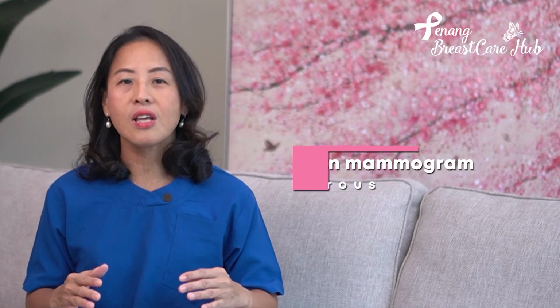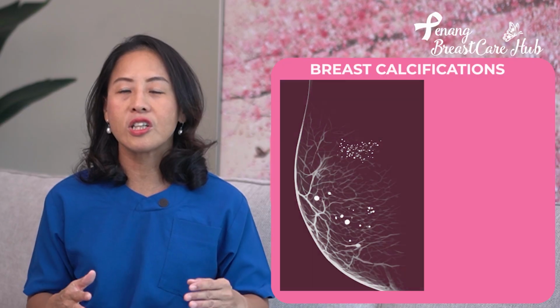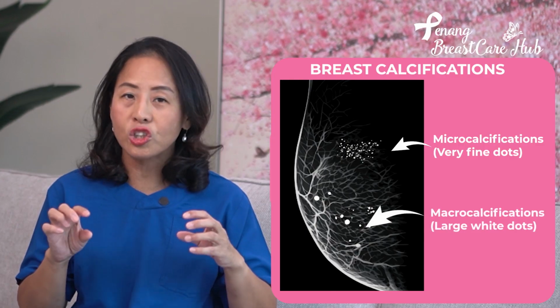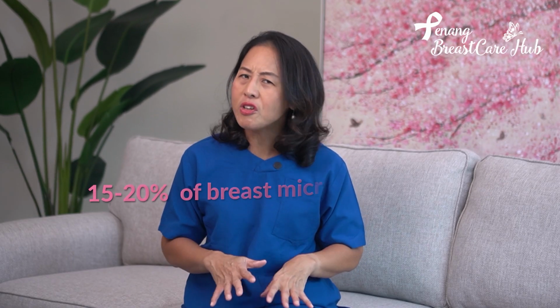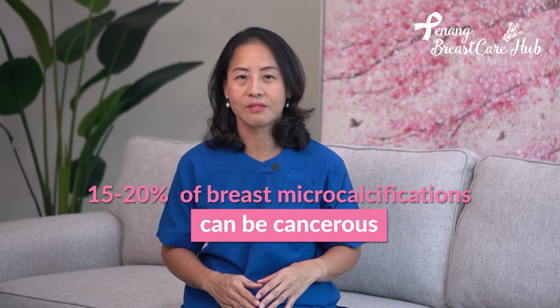Breast calcifications are common on mammogram and are usually non-cancerous. Breast calcifications can be divided into very fine dots called microcalcifications or larger white dots called macrocalcifications. The majority of breast calcifications are not dangerous, while about 15 to 20% of breast microcalcifications can be cancerous.